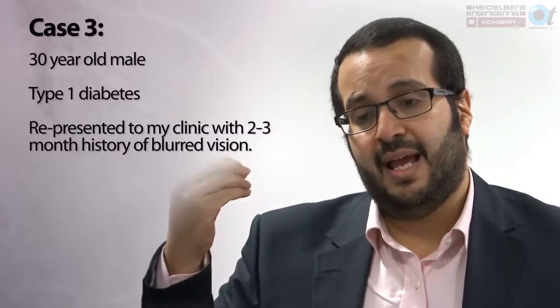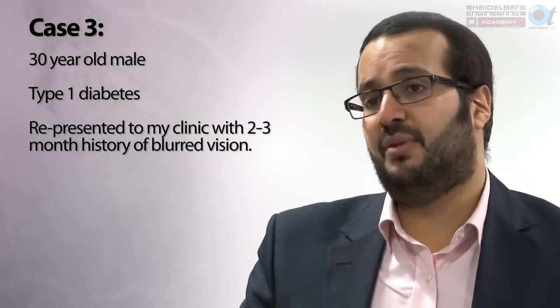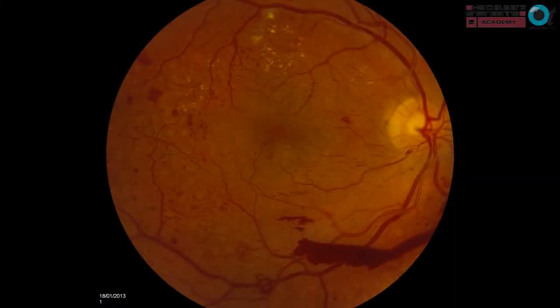And I'd like to just emphasize this with a case of a 30-year-old patient, type 1 diabetes, who represented to my clinic with a 2 to 3 month history of blurred vision. This was his colour fundus photograph. Again, he's got advanced proliferative diabetic retinopathy.